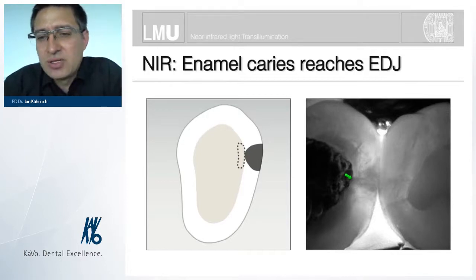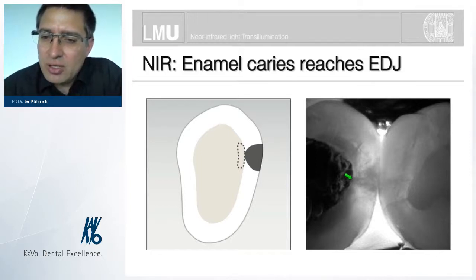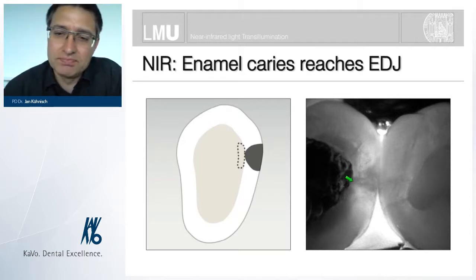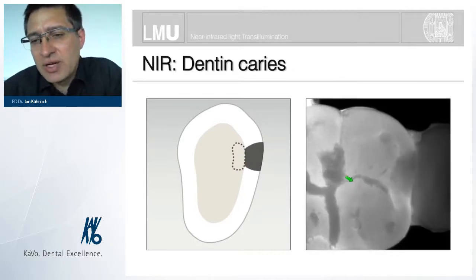early process in dentine is in most of the cases not visualized with this technique. We can assume that the larger the area of the enamel-dentine junction that is demineralized, the more we are taking the next step.